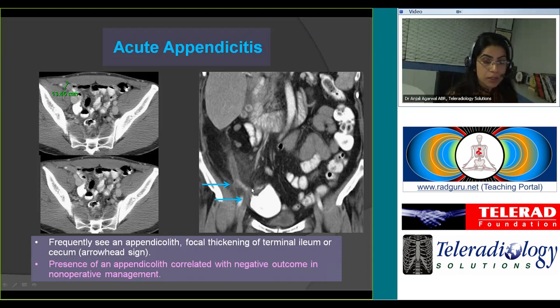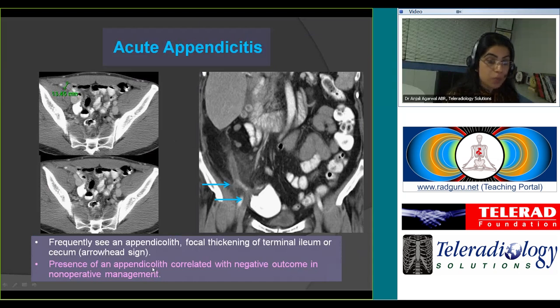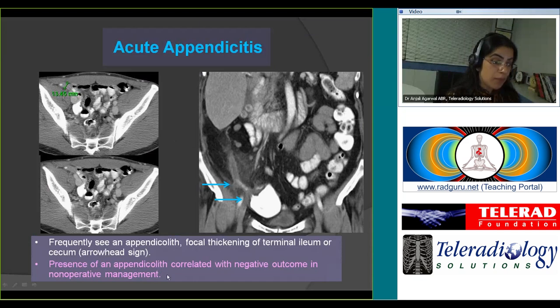This image illustrates the cecal arrowhead sign because of edema at the cecal base, just at the origin of the appendix, nicely forming the arrowhead against the intraluminal contrast in the cecum. An appendicolith correlates with a higher incidence of appendiceal perforation and therefore a negative outcome in non-operative management — appendicitis cases with an appendicolith should be operated.